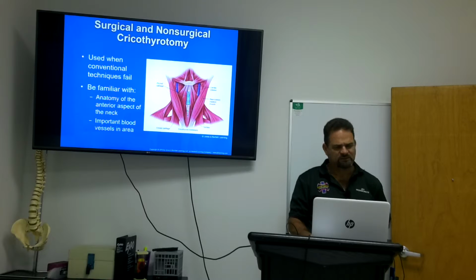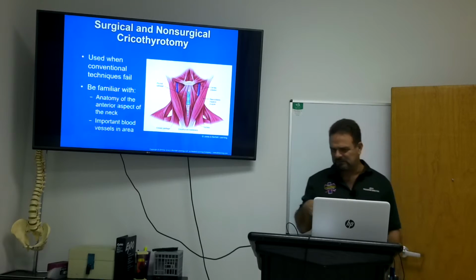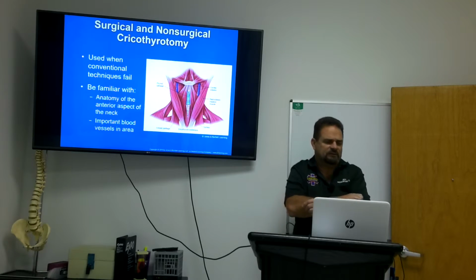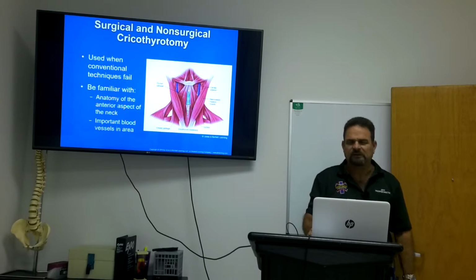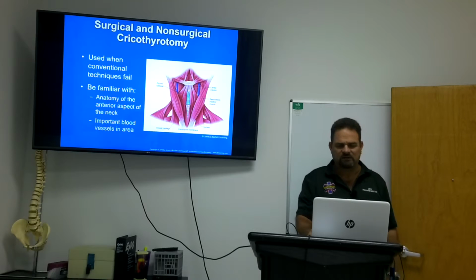All right, surgical and non-surgical cricothyrotomy. When all else fails, we can get into this stuff. This is not something you want to do, not us medics that have been around for a long time. It's the bottom of our list. It's just not a cool thing to do, but you can do it relatively easily and get it done. But I mean, don't be afraid of it. You just don't do it that often.